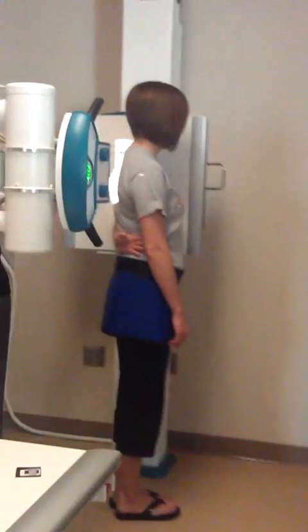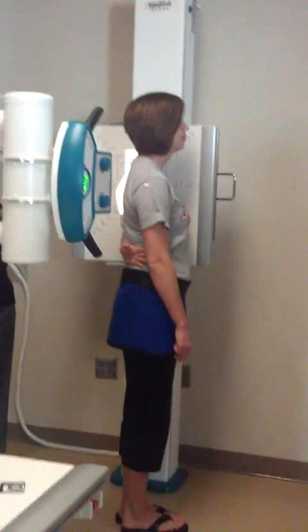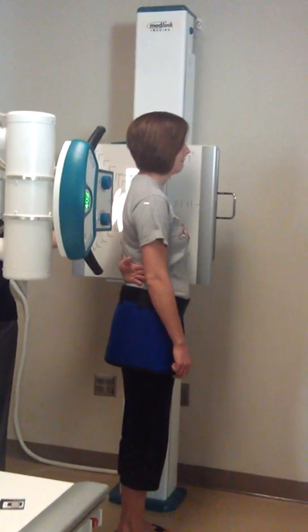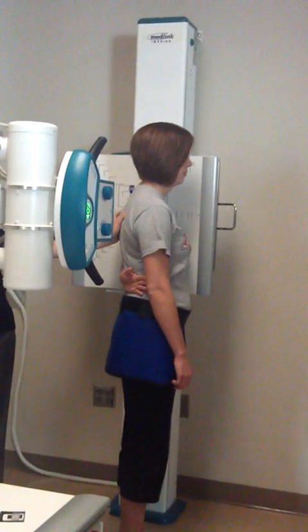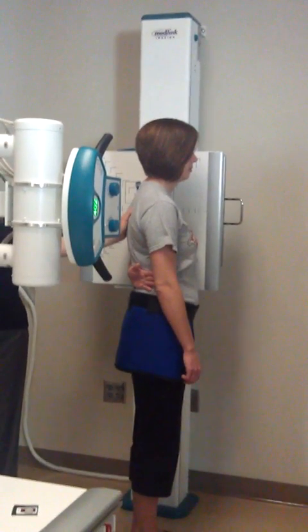Everybody looking — just down that side. I'll turn around you to the right also. This is what I'm looking for: when you oblique your patient, your light field's going to be distorted — it's going to look a little bit warped. It may even affect your central ray. But if you put your thumb and that line kind of goes where your thumb is, then you know that's where you're supposed to be.